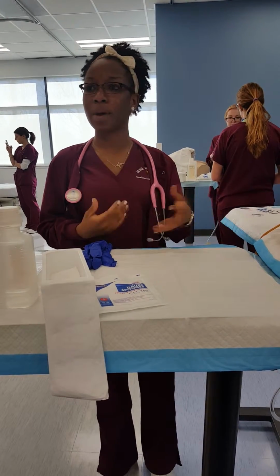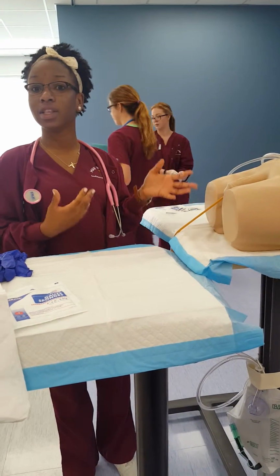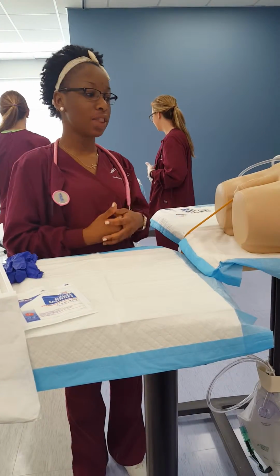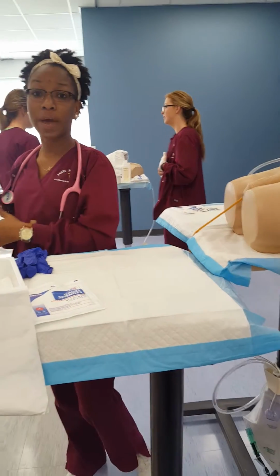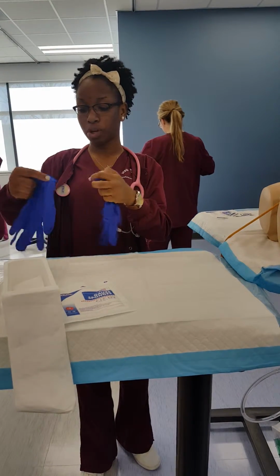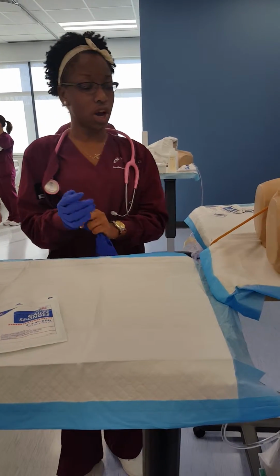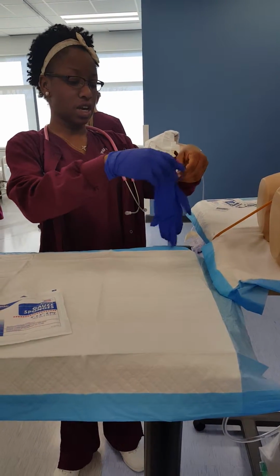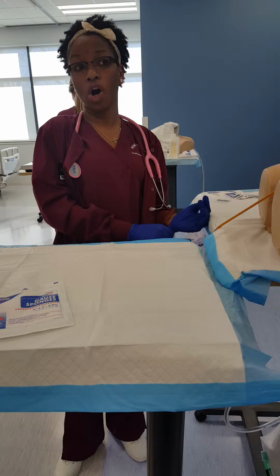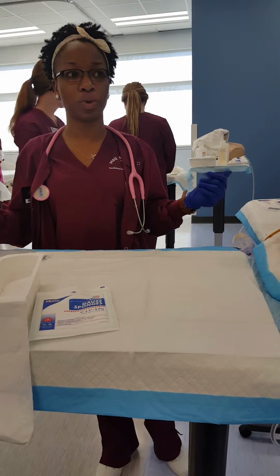So now I'm going to go to my patient's bedside, introduce myself, and ask for the name and date of birth, and also any allergies. Then I'm going to perform hand hygiene, provide privacy, perform hand hygiene again, and put on my gloves. I'm going to tell my patient what I'm going to do, which is to irrigate his catheter and his bladder, just to take away any clot or obstruction that might have occluded the catheter and caused the urinary retention.